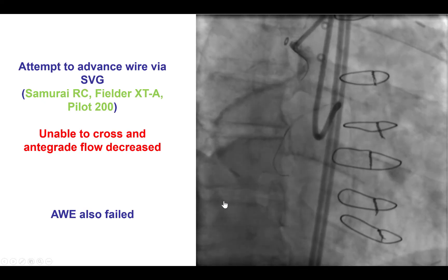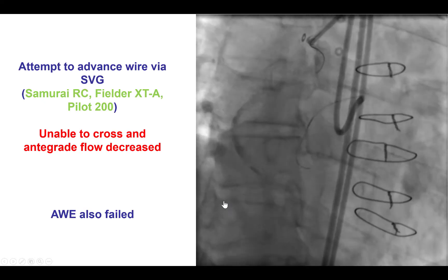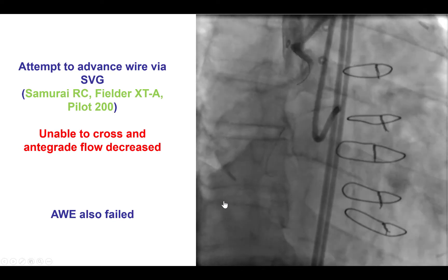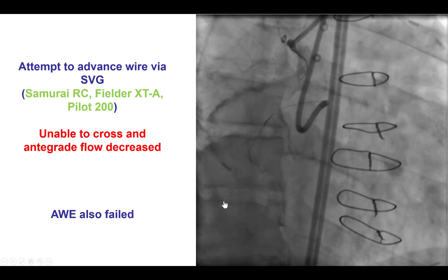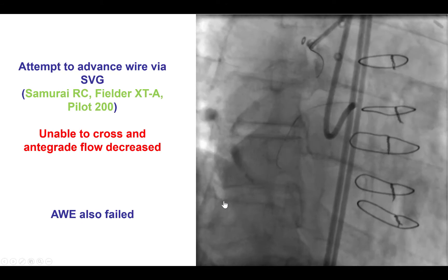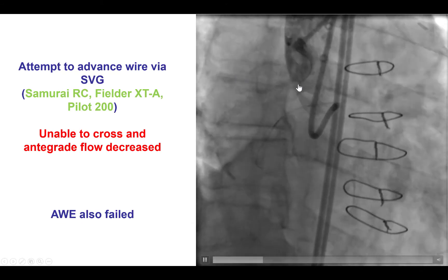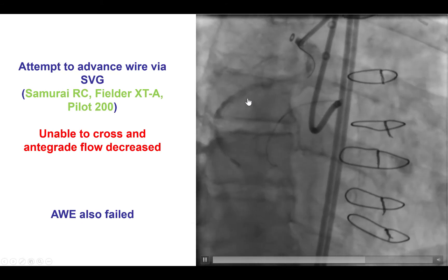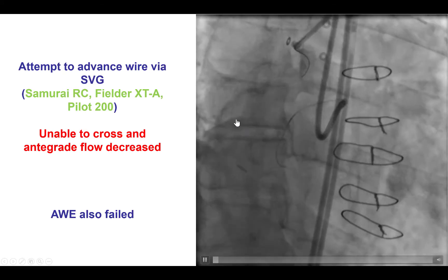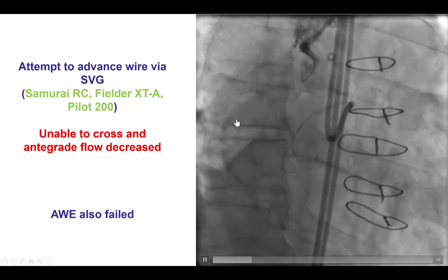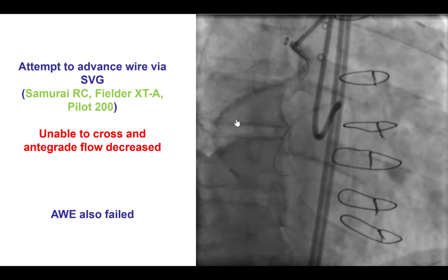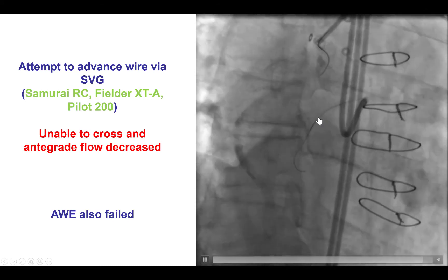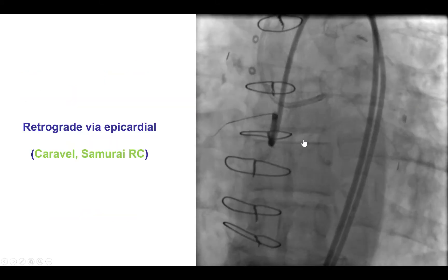We attempted to advance a wire through the degenerated saphenous vein graft. However, despite trying multiple wires both with and without a microcatheter, we were actually unable to cross through this high-grade saphenous vein graft lesion. We also had significant reduction in antegrade flow through the saphenous vein graft, and that is why we changed our crossing attempts, going with antegrade wire escalation.